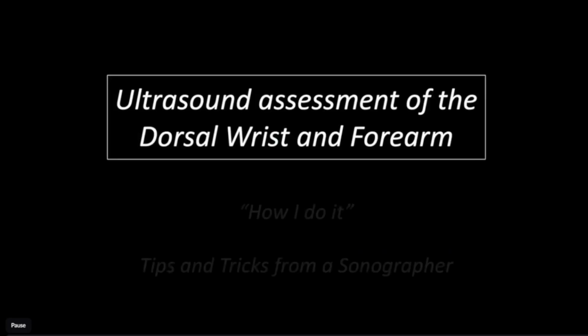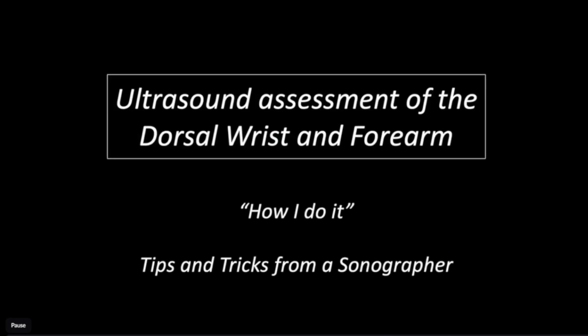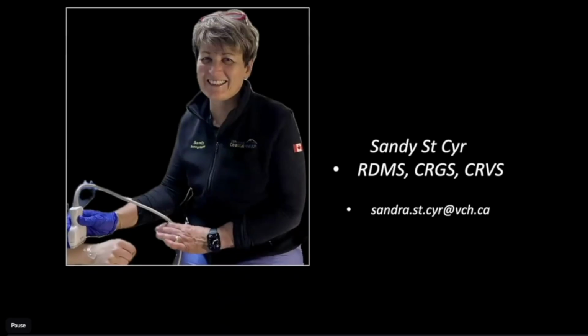Sandy? Thank you. Thanks very much for inviting me, Hugh. Pleasure. Hopefully you won't be sorry. This is me, hard at work, scanning the dorsal wrist. My email for work is attached there, just in case you want to send me any messages.